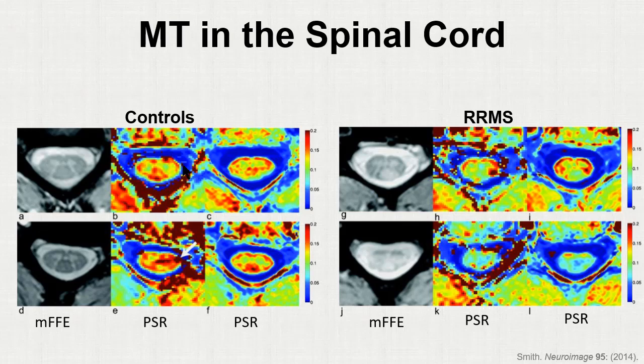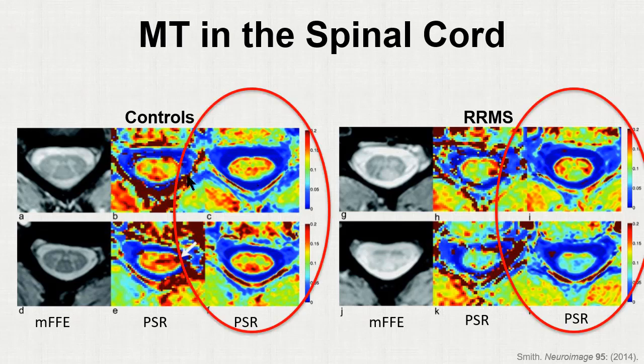Now, I'll show you two of these because there has been a lot of work over the past few years at trying to streamline the analysis for quantitative magnetization transfer to use a single point method. The idea there is that a B0, B1, and a T1 corrected MTR experiment provides us with a good estimate of the magnetization, the QMT parameter of the PSR. So this is that here on the right side. You can see it smooths out some of the, if you will, idiosyncrasies of the data, and it provides us still yet with the gray matter white matter contrast.